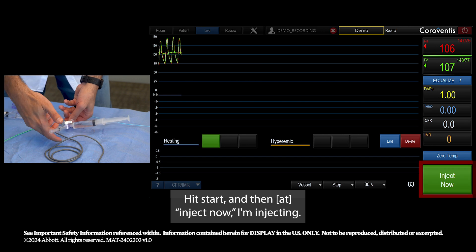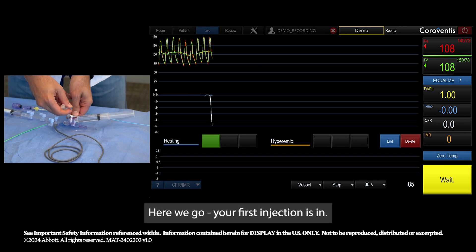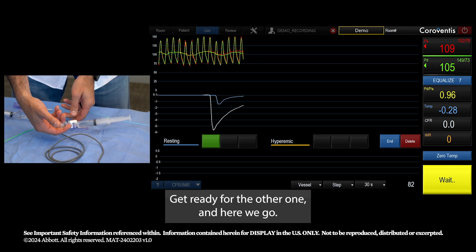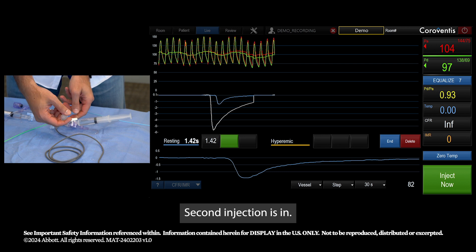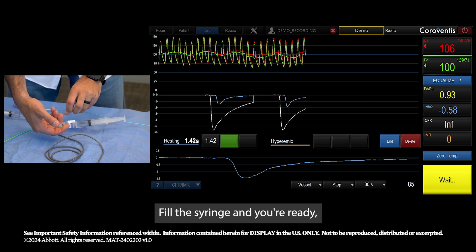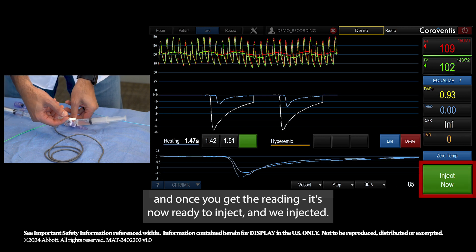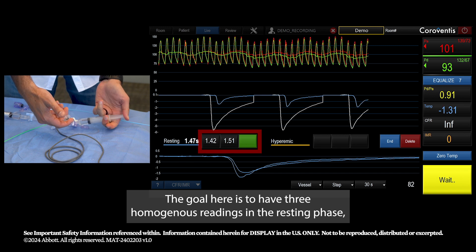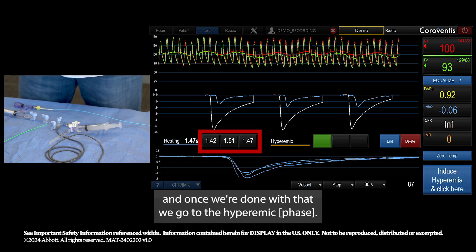Hit start and then inject. I'm injecting — and here we go, your first injection is in. Get ready for the next one — and here we go, second injection is in. Fill the syringe and you're ready. Once you get the reading, inject again. The goal is three homogeneous readings on the resting phase.